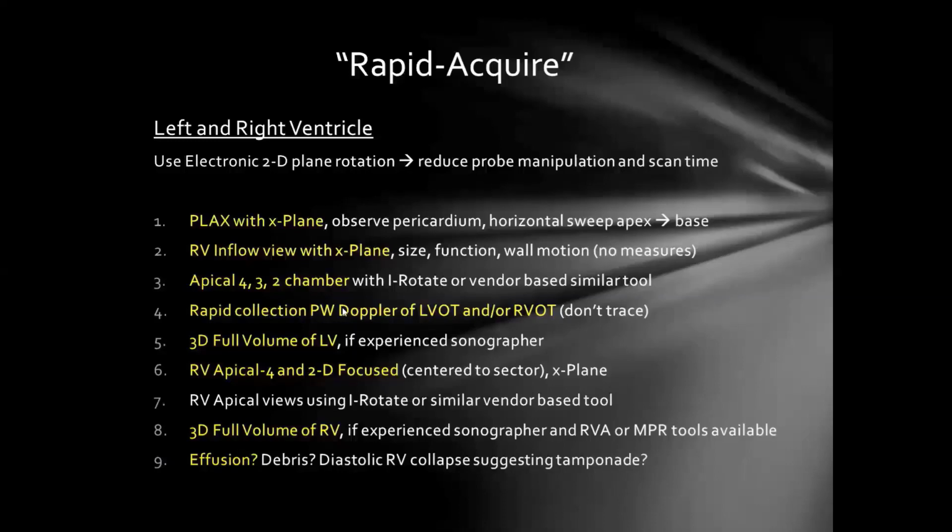It's always good to have apnea. In fact, in any other course or situation, I would be telling you how to get a good apneic data set. In this case, I realize this is a different situation and your time in the room is the most important aspect besides the quality and accuracy of the images.